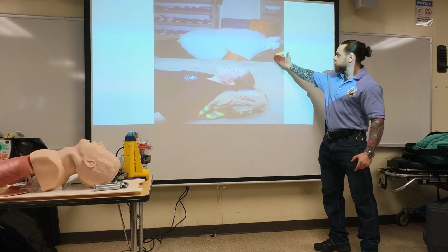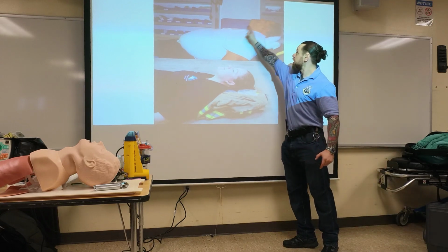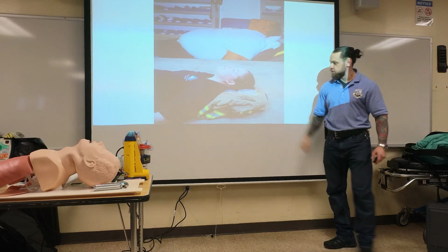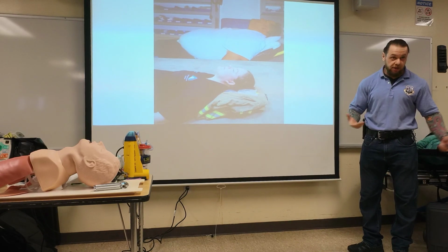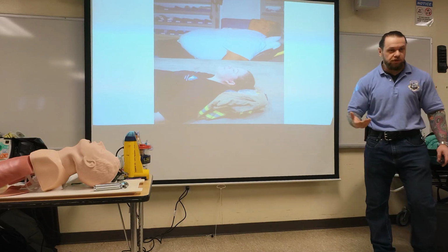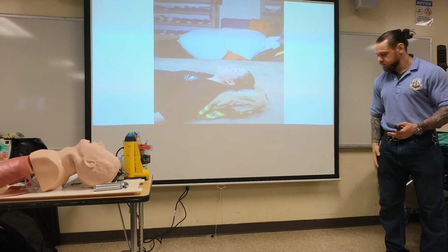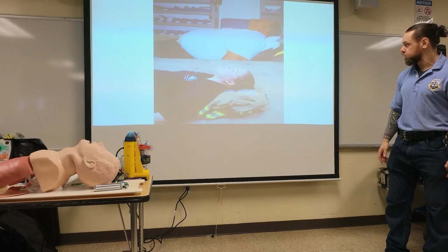Here they use a stretcher, they just put some pillows behind the head. Ear hole, sternal notch, face parallel to the ceiling. Here they use some bunker gear and some fluids, right? Maybe you're on a call somewhere. You could use an oxygen bag that you carry with you, or some other stuff you have. Maybe you always put a sheet on a stair chair that you bring up with you. So you could use those things.